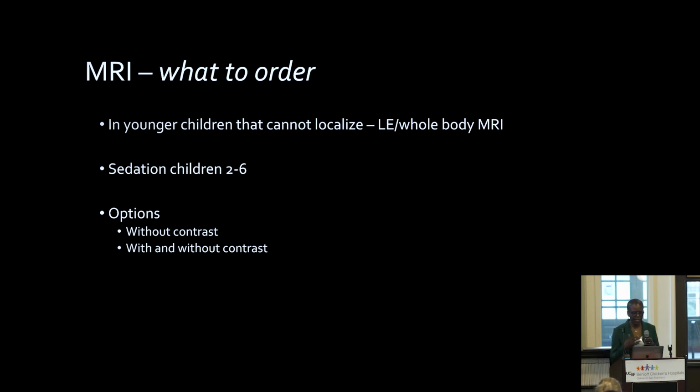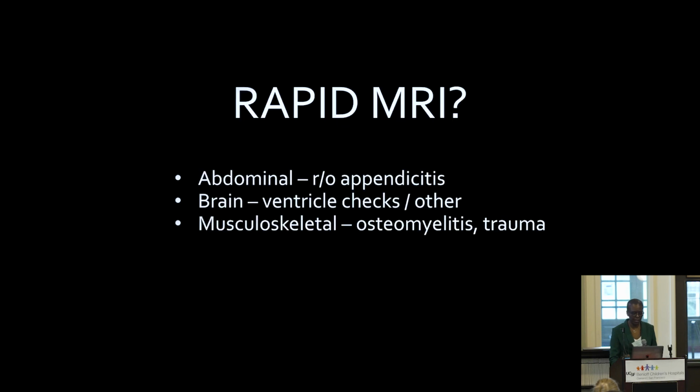And that's done in the same way we do the whole body MRI. Children that are 2 to 6 and even older are probably going to require sedation or anesthesia because this is a longer exam. I'll show you how we do it. And the options are going to be without contrast or with and without contrast.